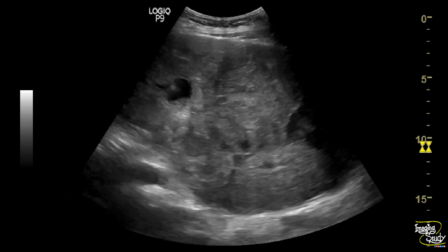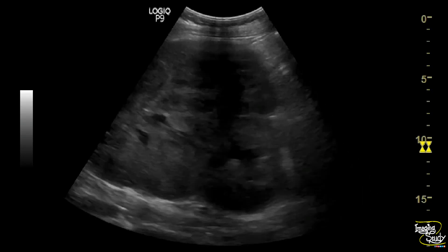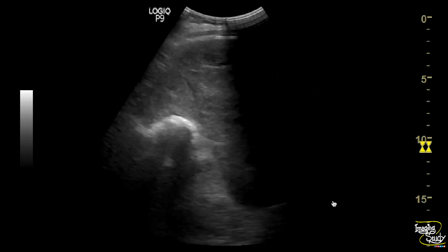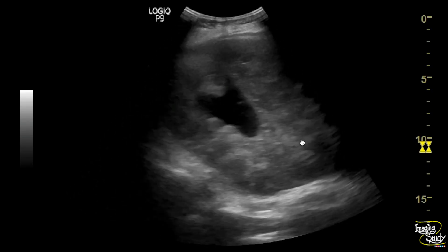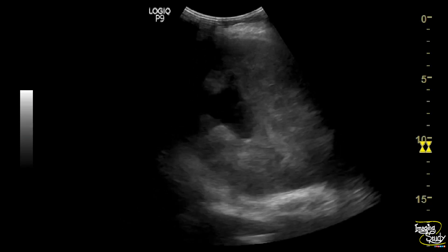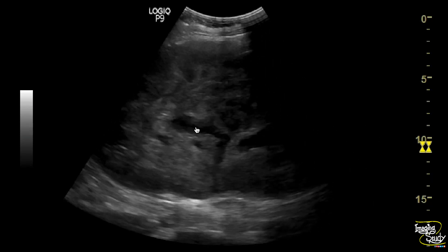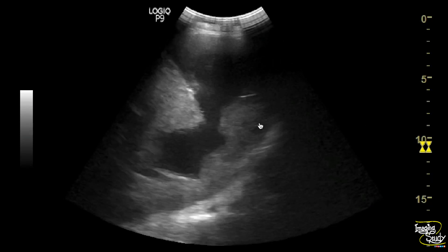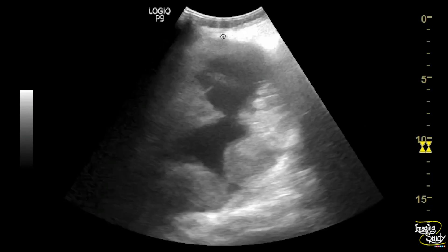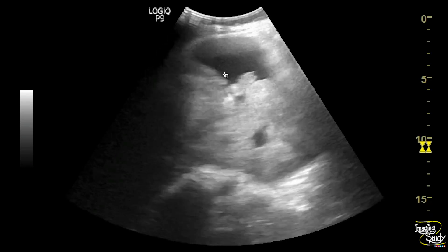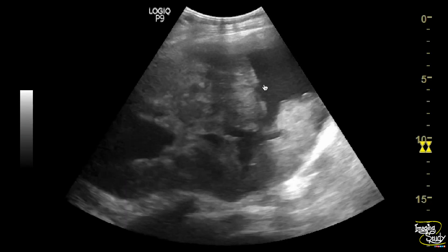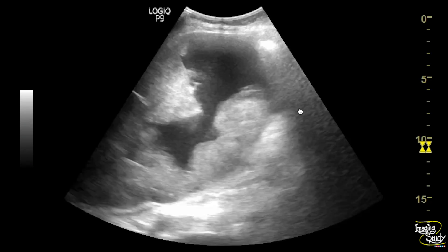Overall, I was looking for any laceration within, and fortunately I found a breach in the continuity of the parenchyma with associated subcapsular collection. This is the urinoma formed due to the defect in the parenchyma.